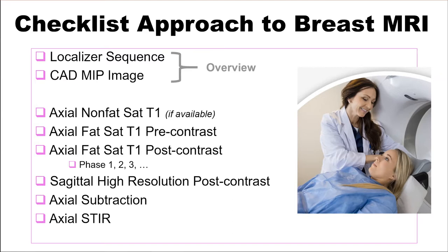This provides an overview. Next, move on to looking at any axial non-fat-saturated T1-weighted images, if available. From there, move on to the dynamic sequence with a fat-saturated T1 pre-contrast followed by the sequential phase 1, 2, and 3 post-contrast images. From there, move on to the sagittal high-resolution post-contrast sequence, then axial subtraction images, and lastly, axial STIR images.